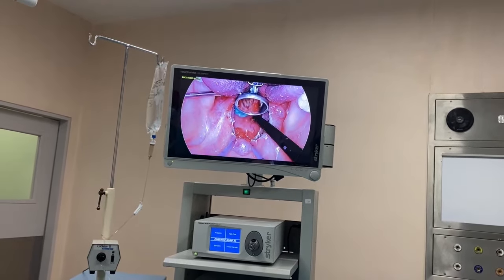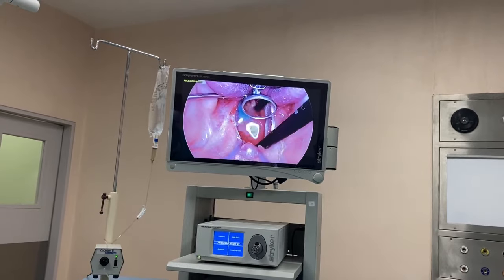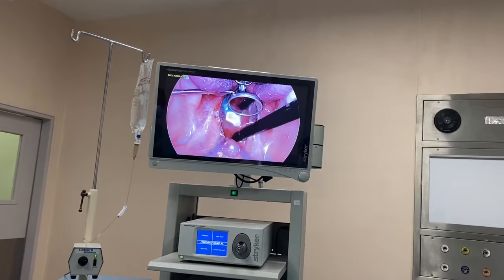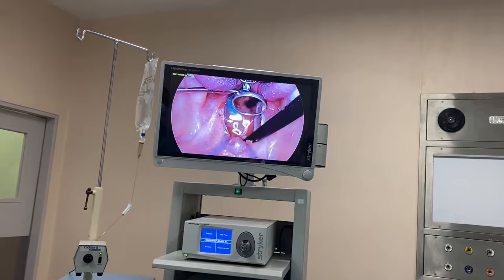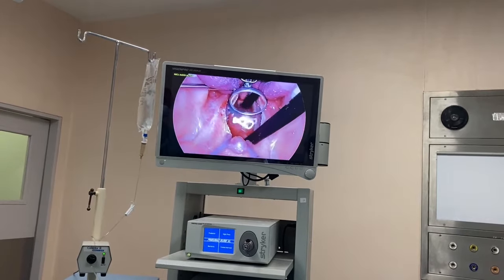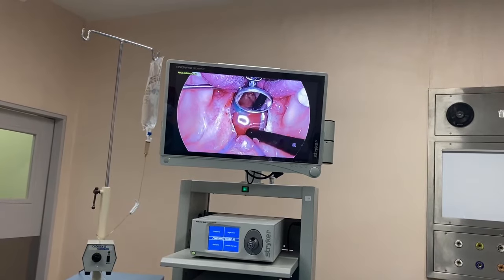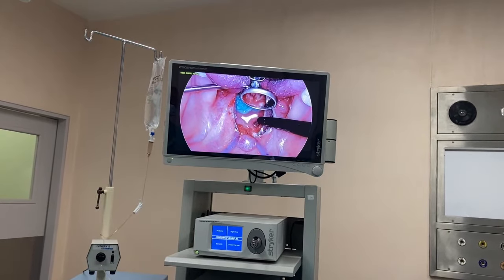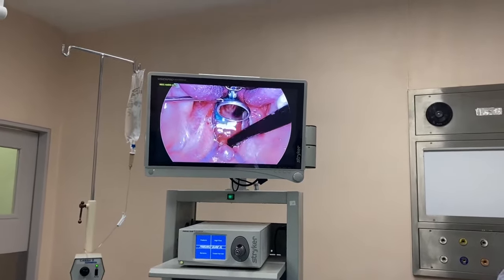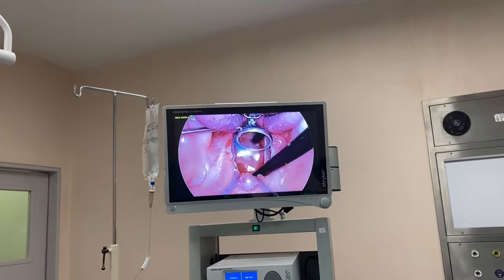This is where most ENT surgeons don't use coblation for adenoids — they only do tonsillectomy. The reason why? Impatience. When they come to adenoids, they feel it is taking time. They just want to go in with a curette and pat, pat, pat. But if you do it gently, you can see what you are doing, you can see what you are removing, and your surgical field becomes clean. And there is nothing like a clean environment.